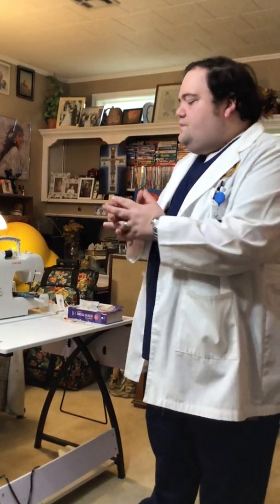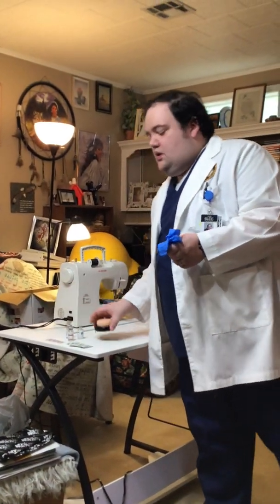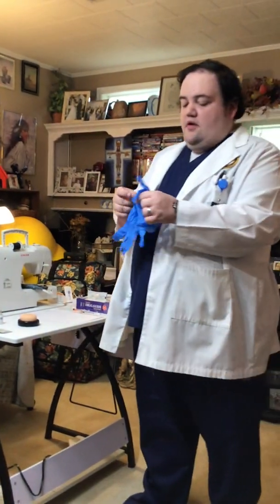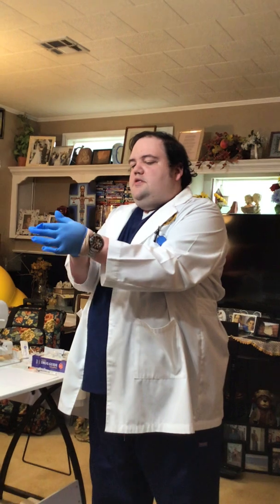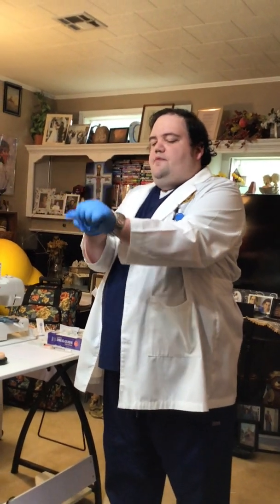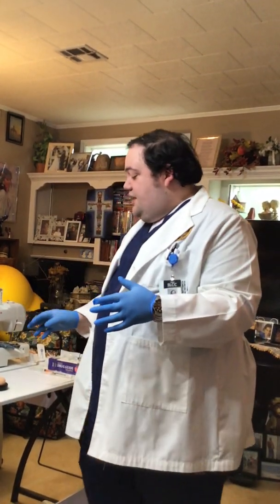We're going to go into the room, and for this portion, we are going to use our gloves as part of standard precaution. The reason we didn't use gloves before was because we did not really have the danger of exposure to body fluids, except our own if we would stick ourselves, but there would be no cross-contamination. We would just have to get rid of the rest of the material and start over. But we're going to actually inject the patient now.